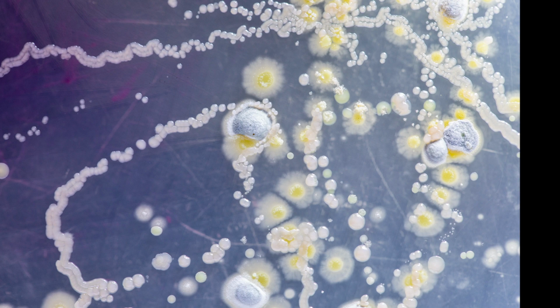But I do think that, of course, you have to feel confident yourself that you know this is the correct way and this is the correct result, and then you should have the reference result somehow. And in these cases, it's probably a molecular test, both for the beta-lactamase in Staph aureus and for vancomycin resistance in enterococci. And that's mainly VAN-B mediated resistance. Most of the VAN-A mediated resistance will have no zones at all, so that's not difficult.